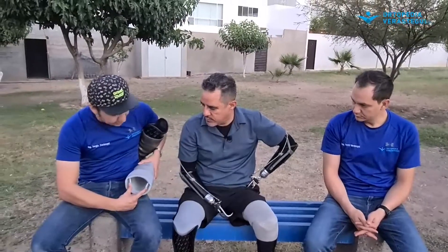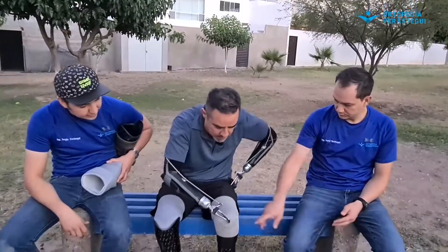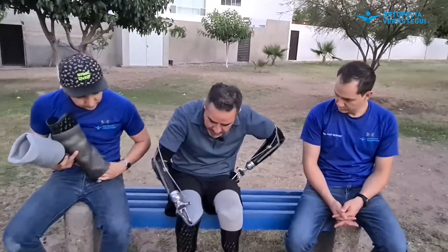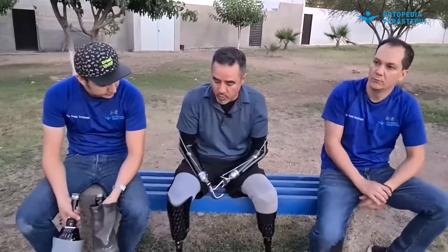Como hay mayor vacío, todo lo que es flexible se acomoda a la piel. Acá te quedan ciertos espacios — aquí hay vacío pero hay este puñito. Aquí es un vacío condicionado, y aquí el contacto es directo. Yo sí lo siento mucho más confortable, mucho más seguro, mucho más te eleva la actividad de movimiento porque te da esa confianza.